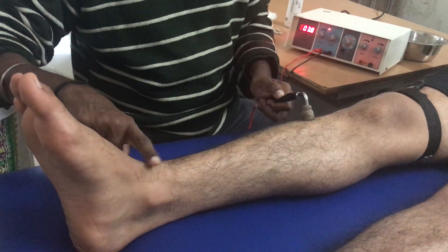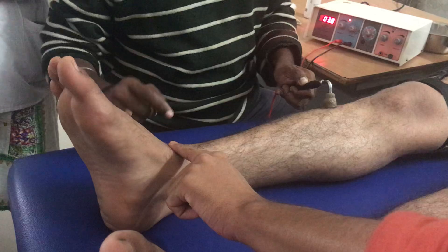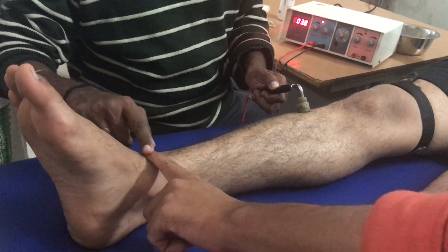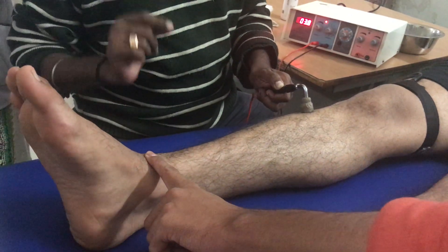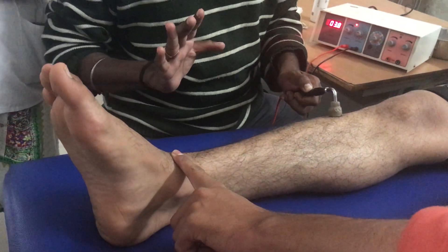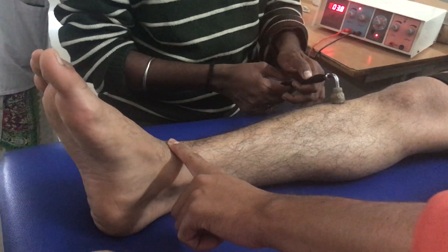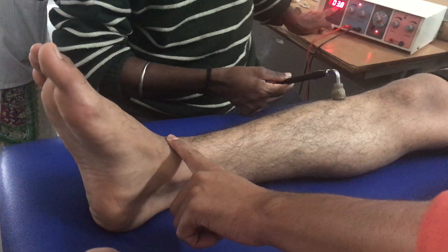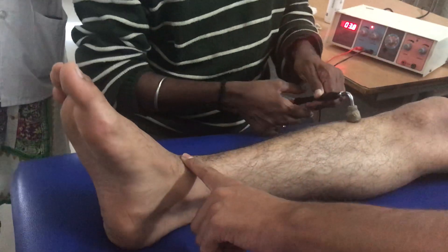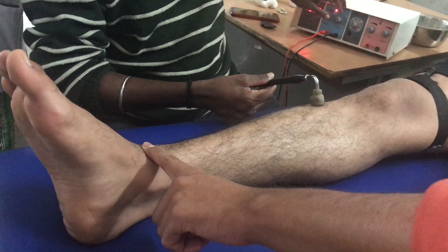Now we are going to assess the strength of the contraction. Please use your index finger to palpate and check the strength of contraction. Monitor that strength — you need to know how much strength there is, because you are going to measure this strength until the last duration. Note that the skin is also pliable, so be very careful not to move the electrode too much. That is why I said to mark the motor point. It is 3.8mA now.